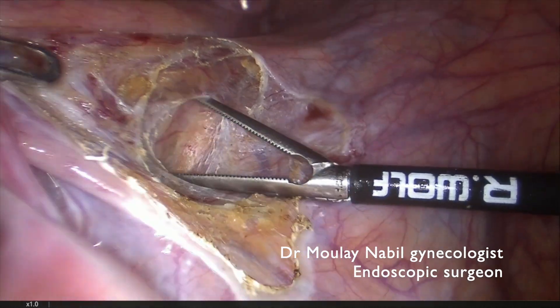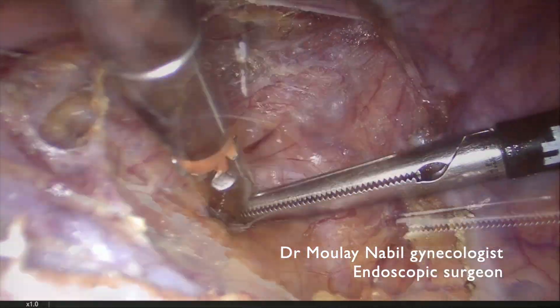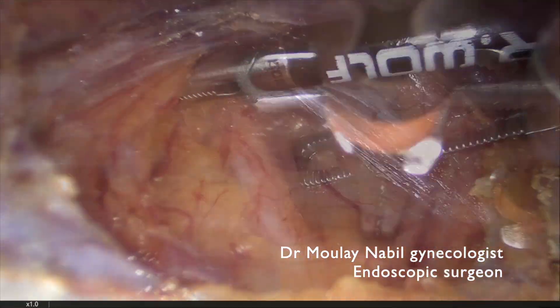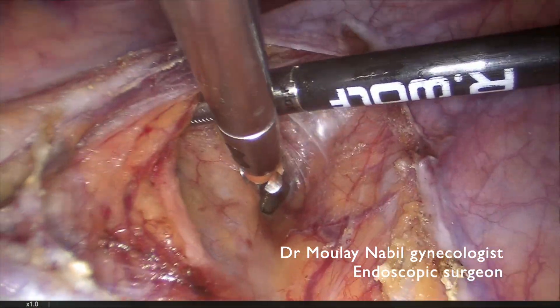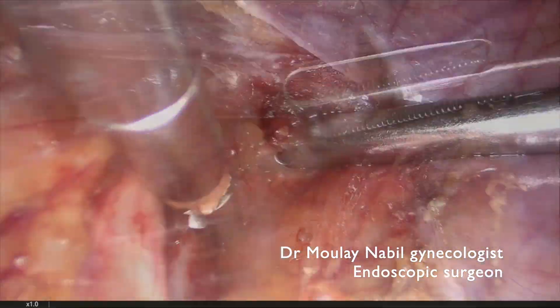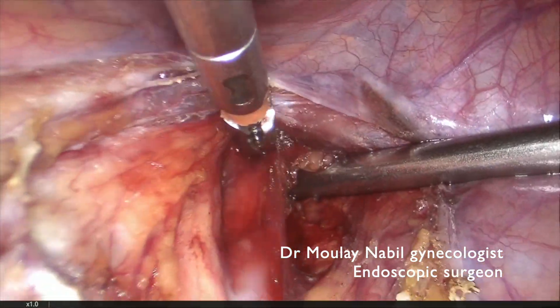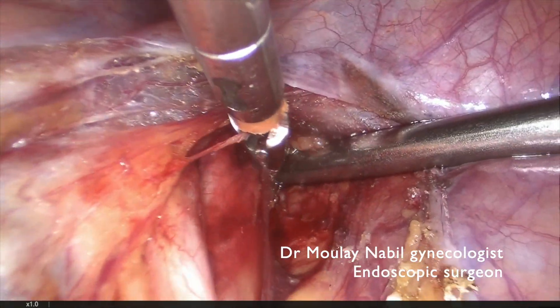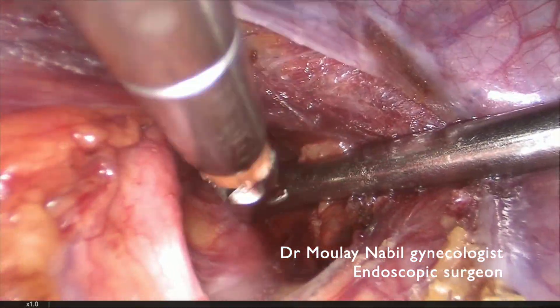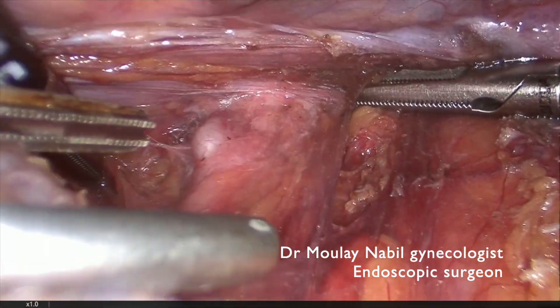We open the peritoneum lateral to the IP ligament, just above the external iliac artery and vein, and we try to recognize our classical landmarks, which are the ureter medially. We will open the space laterally to the ureter to try to discover the internal iliac artery. By progressive traction and counter-traction we can identify quickly the anterior trunk of the internal iliac artery.